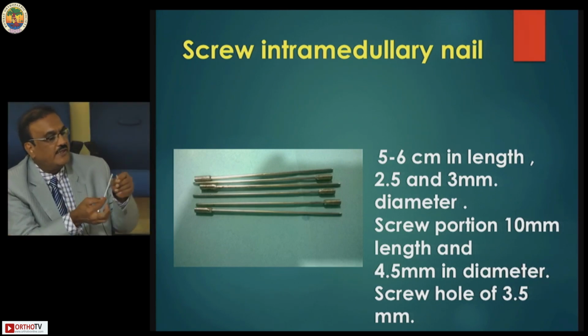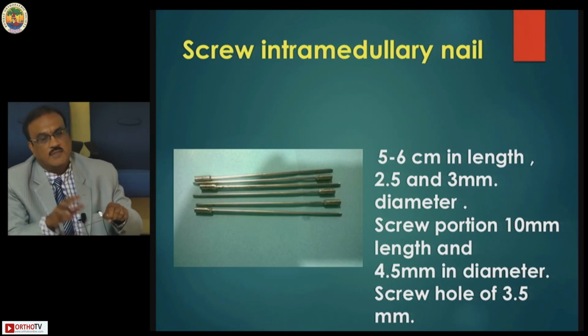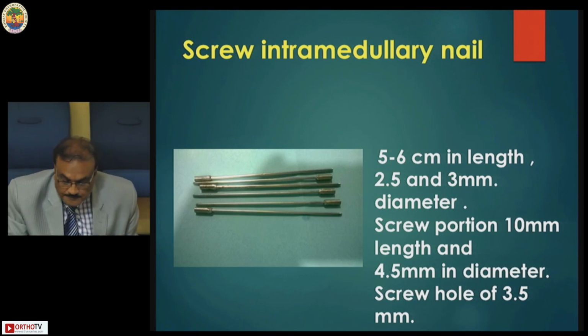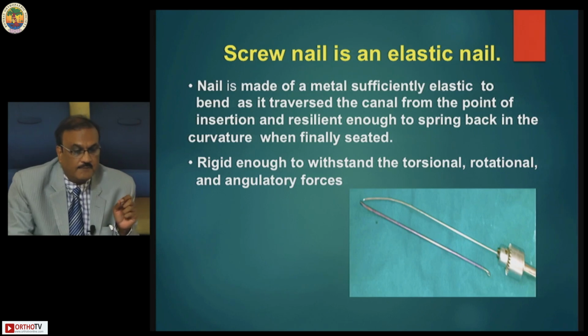So I will show you the video also, and this is malleable, it can go here and there, but it should not be less than 2.5, otherwise it doesn't work, and should not be more than 3 mm, otherwise it is too stiff. So it should be between 2.5 and 3. So the screw nail is an elastic nail.